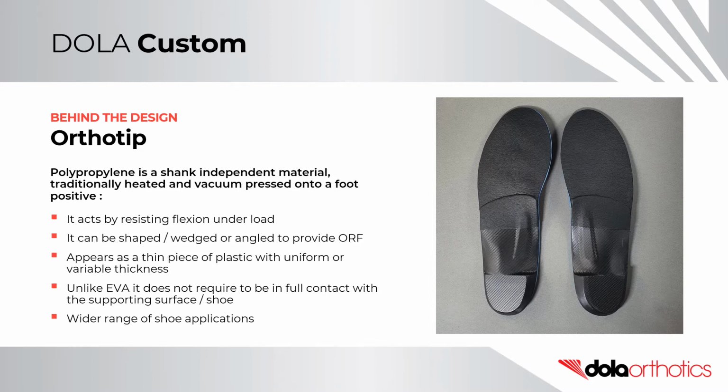A polypropylene shell will support the foot and the arch in a shoe with a narrow waist, as it does not require support from below to resist load. The medial and lateral arch will still support the foot without touching the supporting surface.